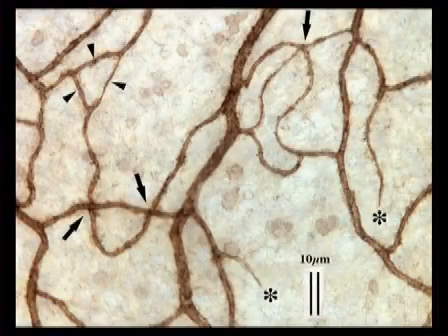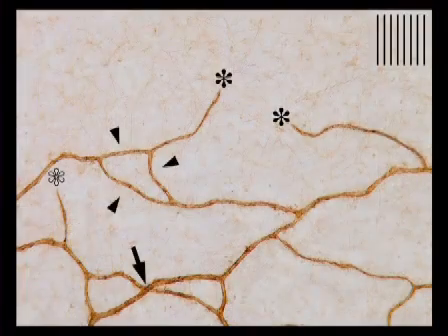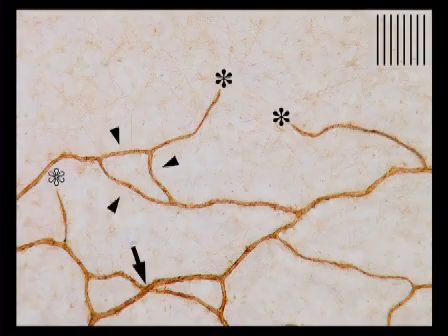Because of the ability to quantify objective angiogenesis variables, the high degree of biological relevance of the system, and the possibility to check for toxic treatment, the methodology is uniquely suited to structure activity and dose-response analyses.